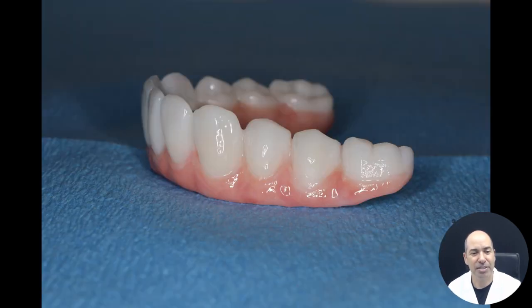She might want to go a little bit brighter, she said. I like this color as is. And she's ready to move forward. So we take a few more pictures, make sure our midlines are on, the slant is on, everything just looks spectacular, and the bite is good. And she shows more upper teeth than she used to. Now I'm going to go to the final. I'll transition, make another scan, and go to the final.